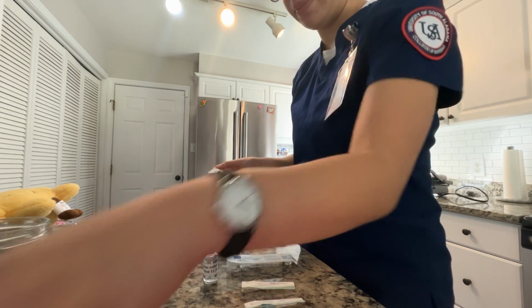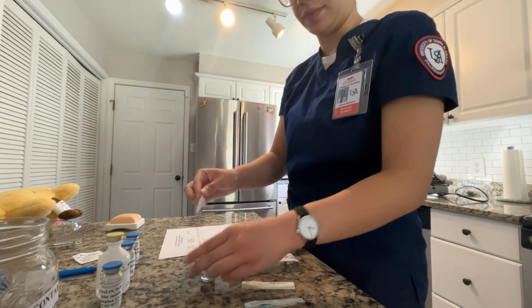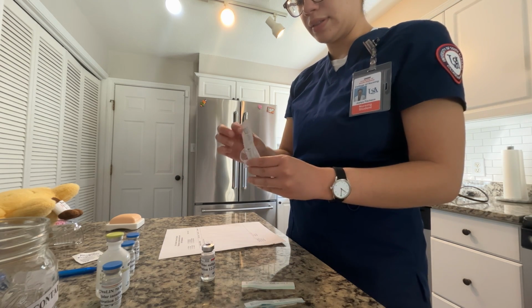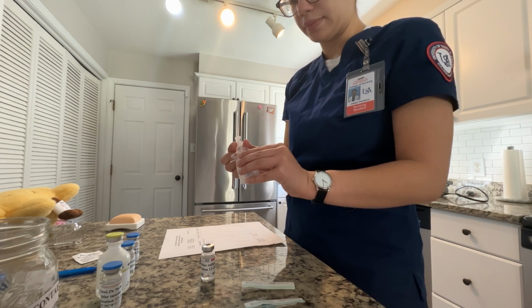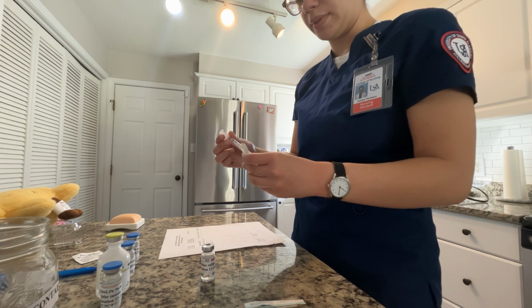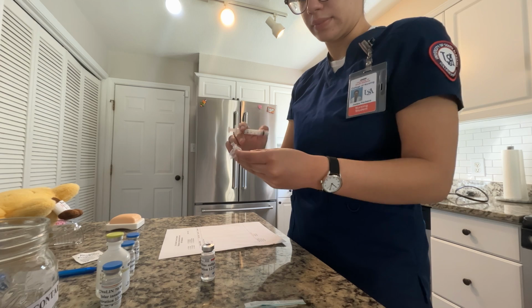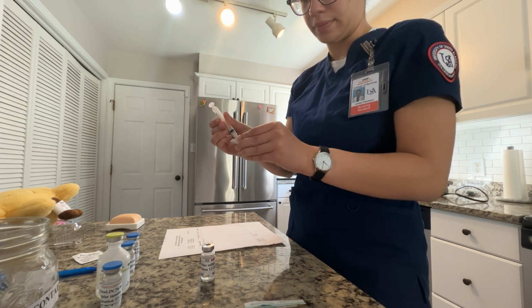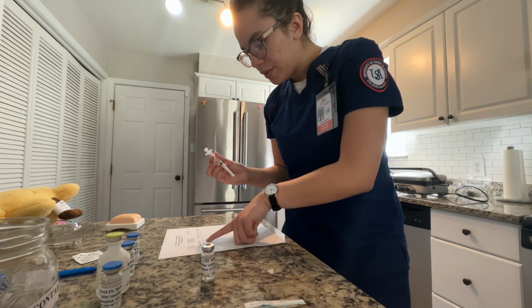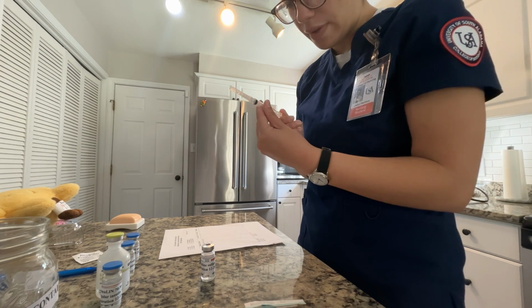So I'm going to clean my vial with an alcohol pad. I'm going to open up my Luer-Lok syringe. And I'm going to open up my blunt cannula. Screw this on here. So he is to receive 5 milligrams, so I calculated 0.5 milliliters. So I'm going to draw 0.5 milliliters of air.